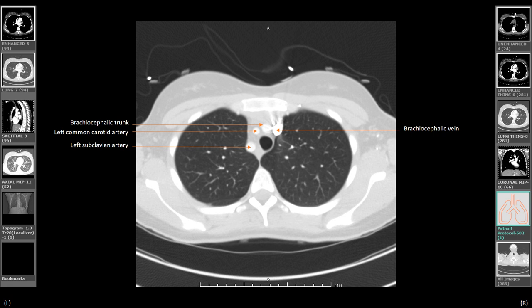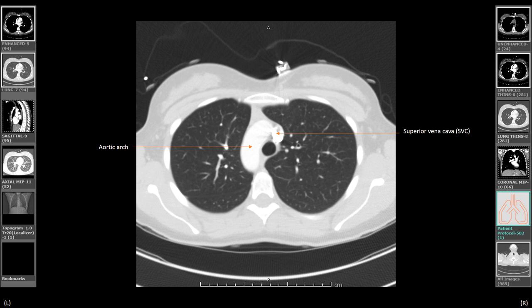Once again, remember, in this image the right side corresponds to the right side of the patient. As we continue navigating down into the trachea, the aortic arch will be on the left at the 9 o'clock position, and curving to the right. As we are about to reach the main carina, the superior vena cava is lateral and will receive the azygous vein on the right at the 3 o'clock position.